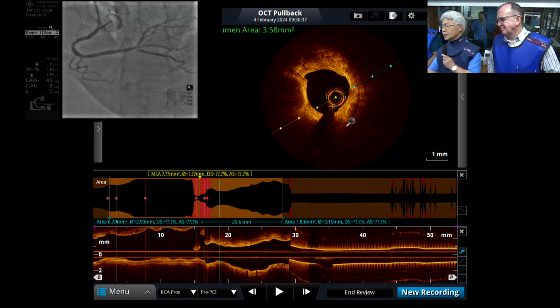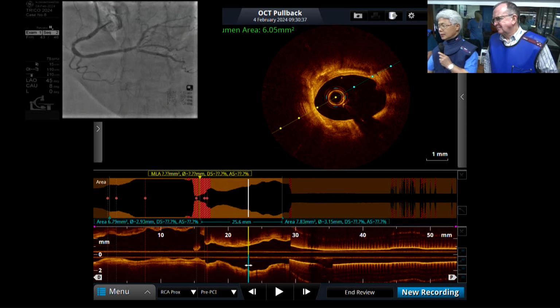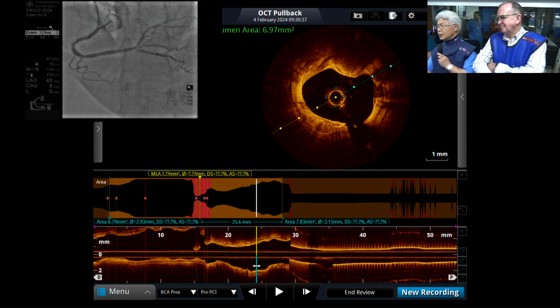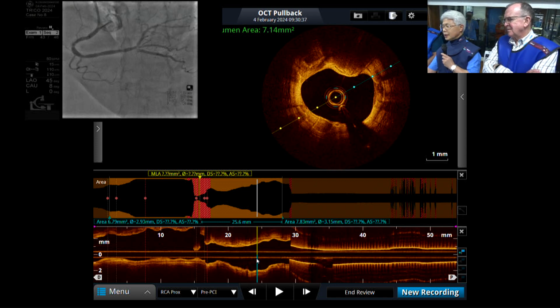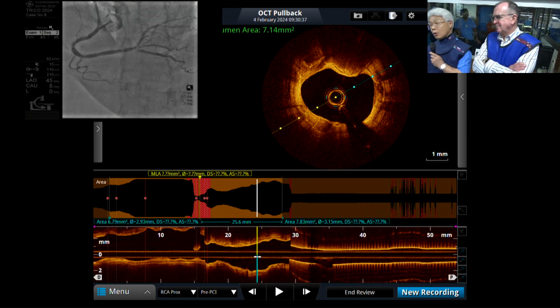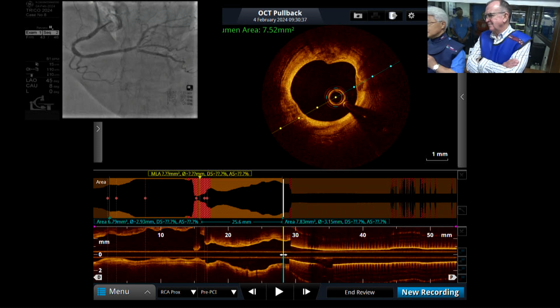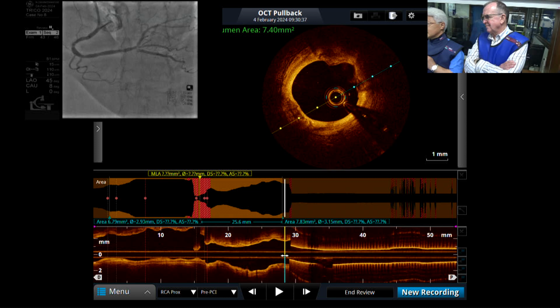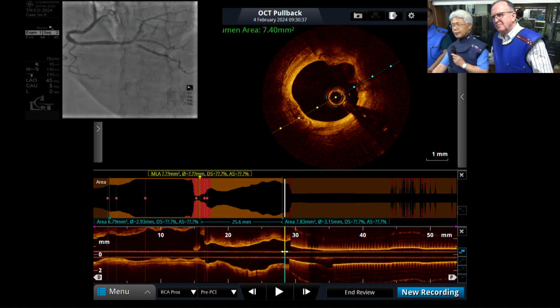Calcium here, and a very complex lesion, right? And then back to the proximal site, also healed plaque, right? And also another calcium here, right? And superficial calcium on the opposite site. Very complex lesion, right? And the true proximal should be okay, but some calcium can be identified. Yes. Very complex. So now, what should be the strategy?